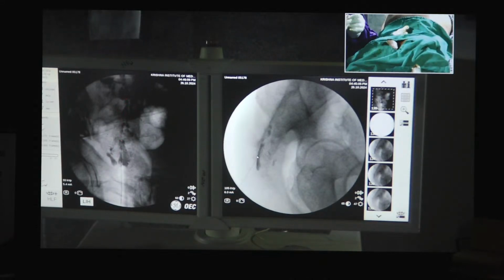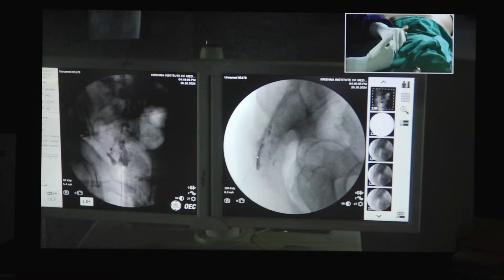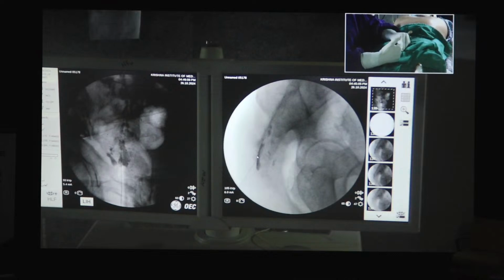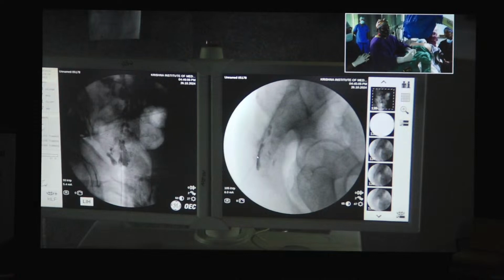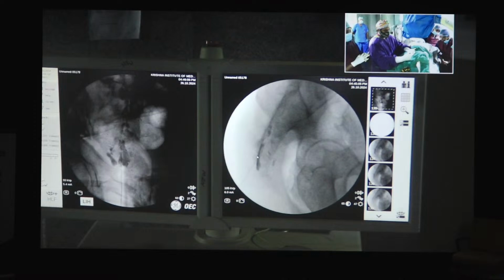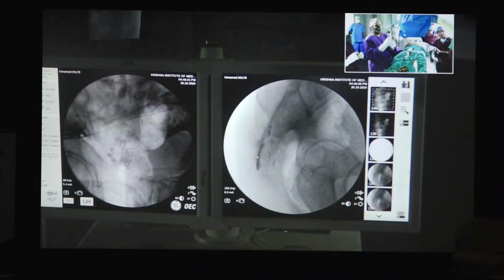So now we are mixing the Kenacort and the local anesthetic 0.25%, and we are giving 8 ml of volume into the caudal canal. While giving the drug, the patient might feel a bit of pressure inside the canal. So we have to alert the patient that it might be painful sometimes while injecting the drug into the canal. We can see the contrast disappeared and the roots can be delineated nicely.